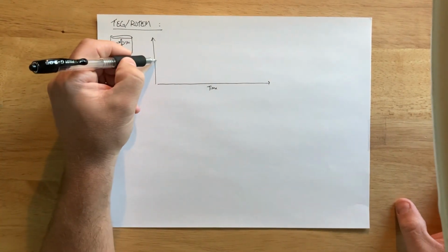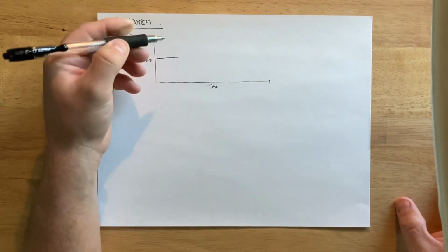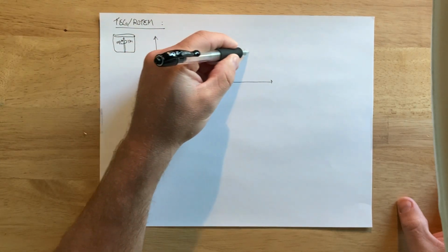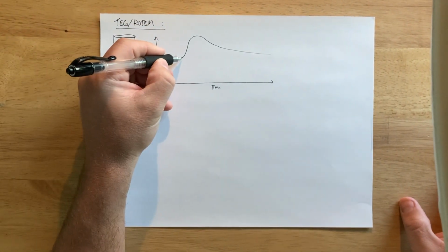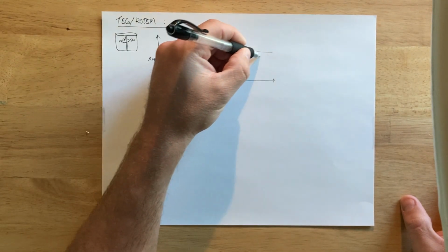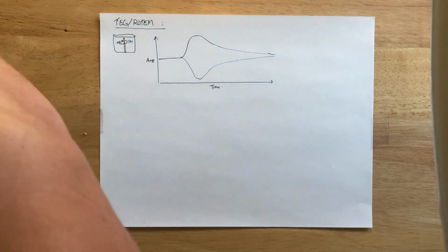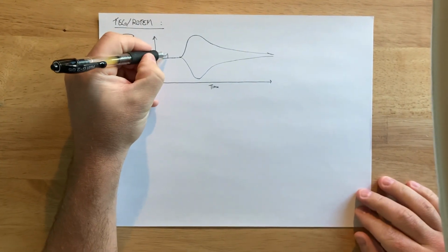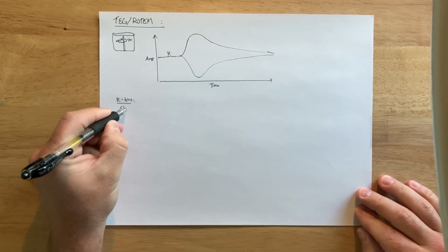As the blood is just introduced, it's liquid, not very viscous. But then once the clotting process starts, there is a slope. And then eventually there's a lysis process. Well, this is a 3D process happening on a 2D tracing, essentially, okay? And so you have a time before the clot starts, which is our R time, okay? This is the time until it starts.